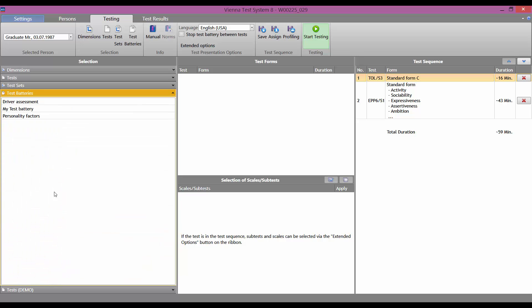It is easy to select any saved test battery in the left-hand column in the Test Batteries sub-menu.